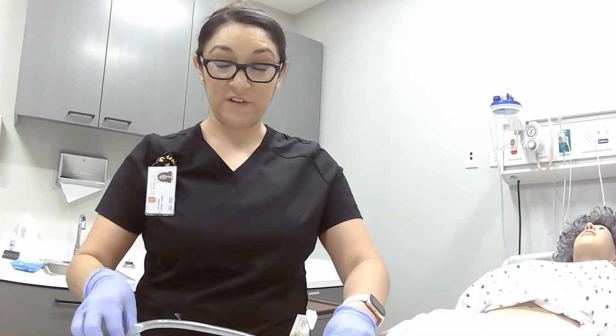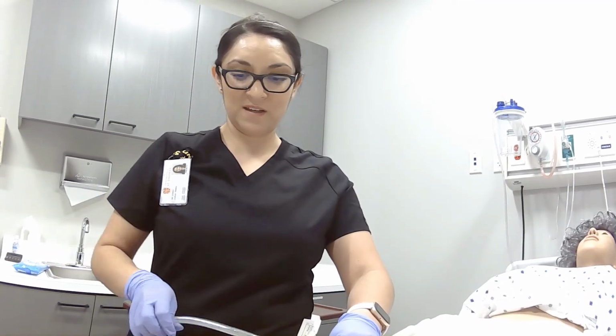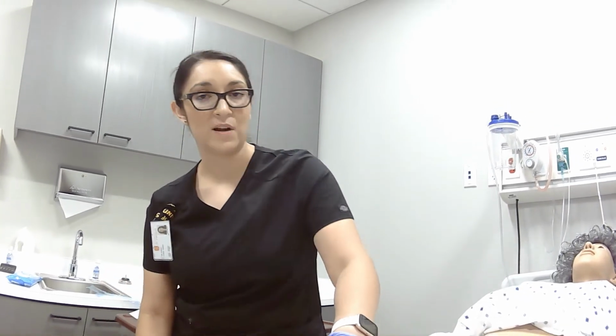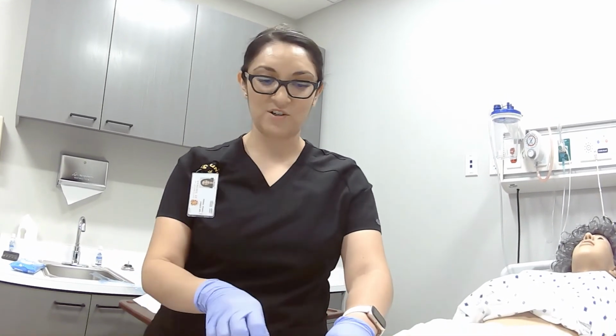And then once you've finished collecting the urine, you would unclamp this. You want to make sure that this is intact and that it doesn't stay clamped, because otherwise all that urine is going to reflux back into the patient's bladder.